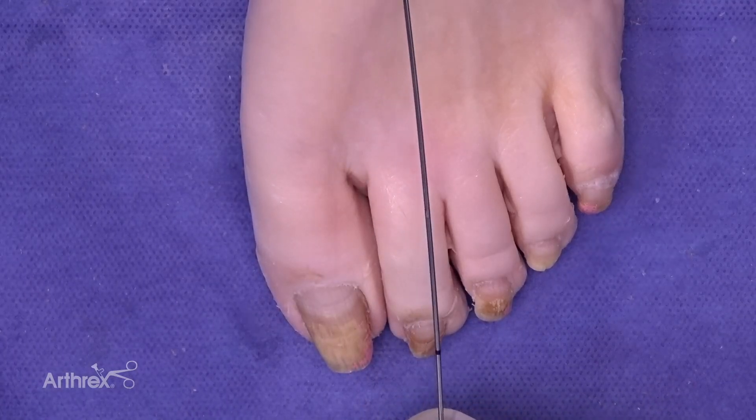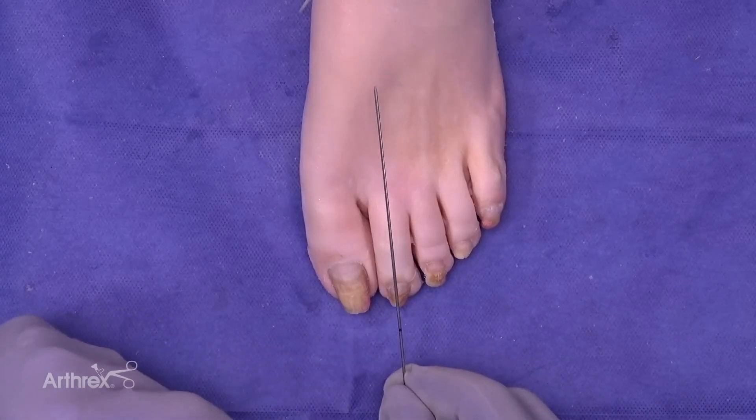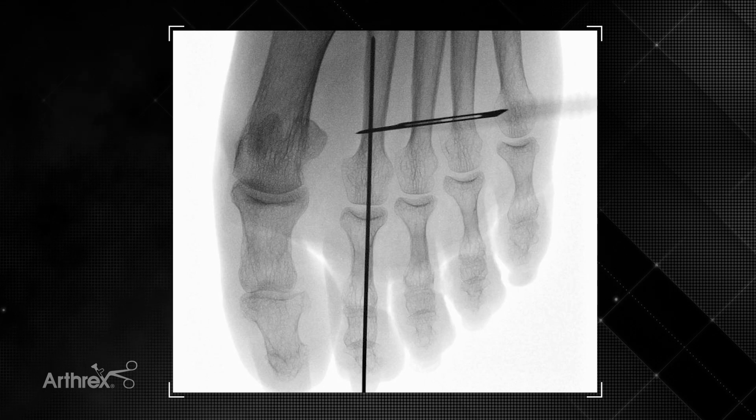With this particular wire, there's a laser mark at the end which will be at the tip of the toe. We can check this under fluoroscopic imaging to identify where we want the wire to end at the most proximal aspect inside the second metatarsal.